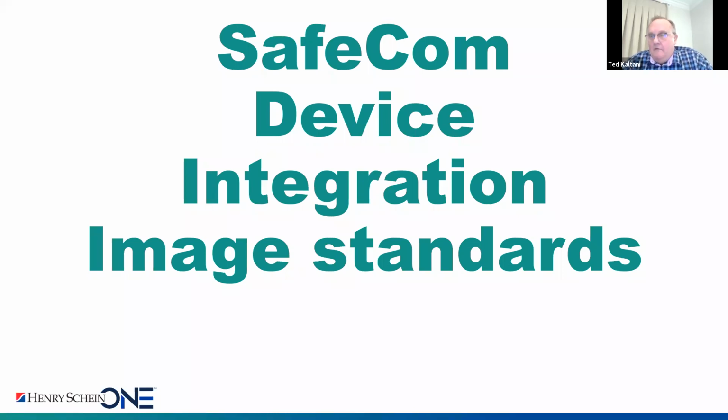So all our vendors are approved. We do not deal with non-approved vendors, but if a product comes in that doesn't have that standard, I wouldn't even consider touching that product because it's not approved as an image or a diagnostic device by our health units, by Health Canada in our case.